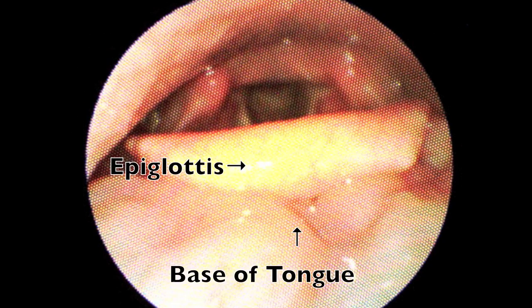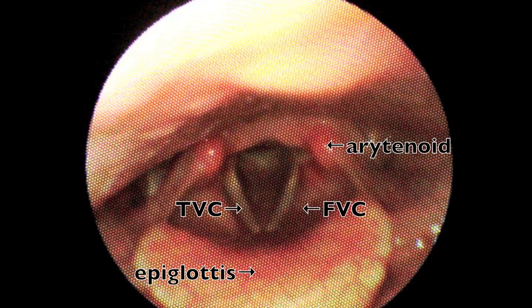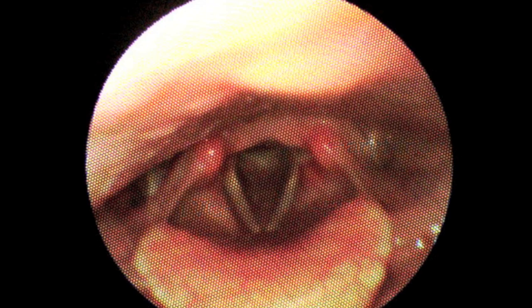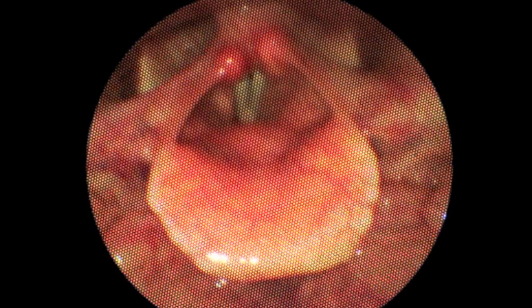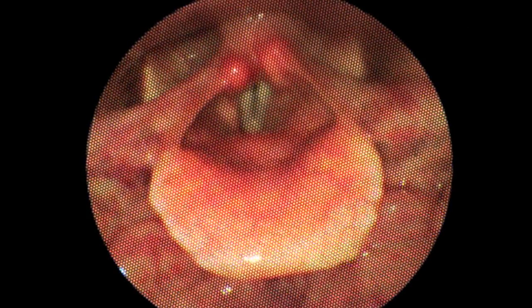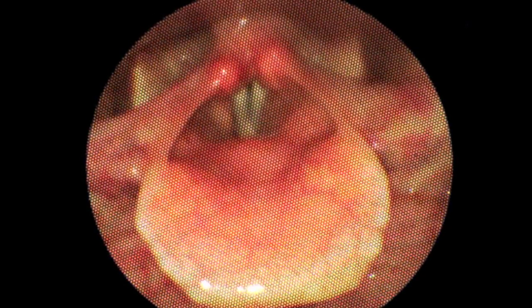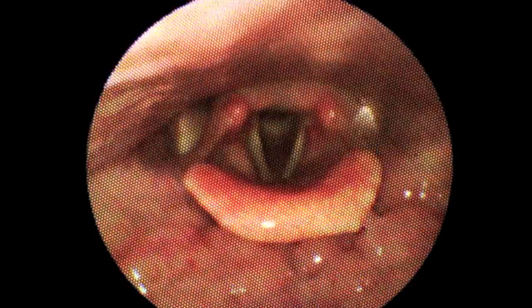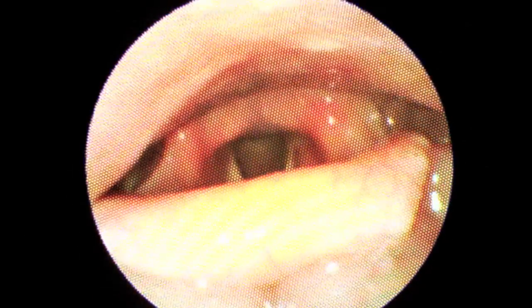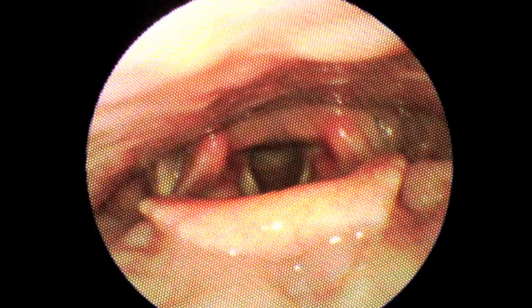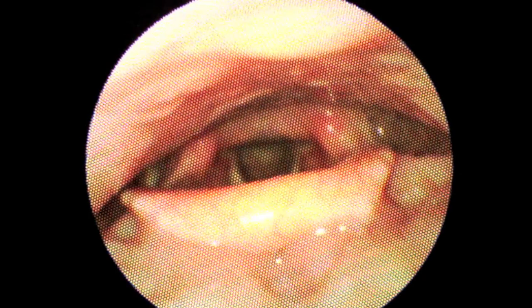As we continue to insert the endoscope, we will be able to closely assess the anatomy, observing the posterior pharyngeal wall, the piriform sinuses, the arytenoids, the inter-arytenoid space, the aryepiglottic folds, and the true and false vocal cords.